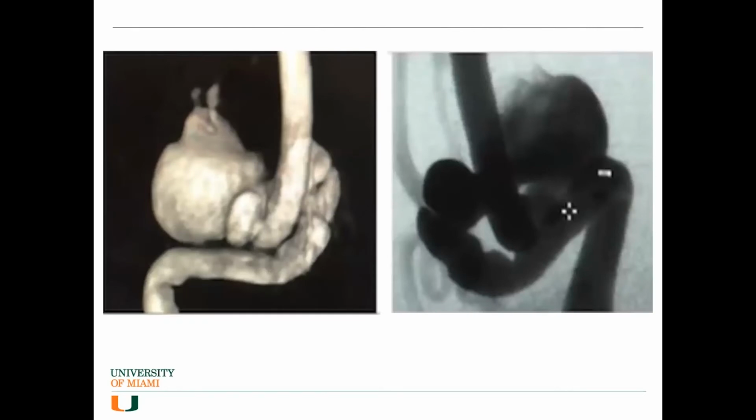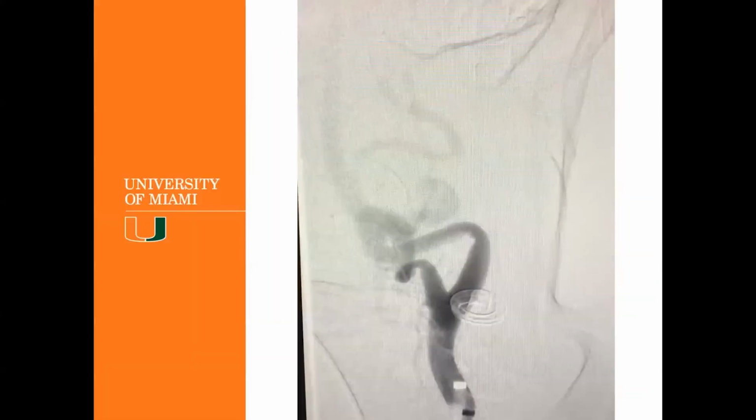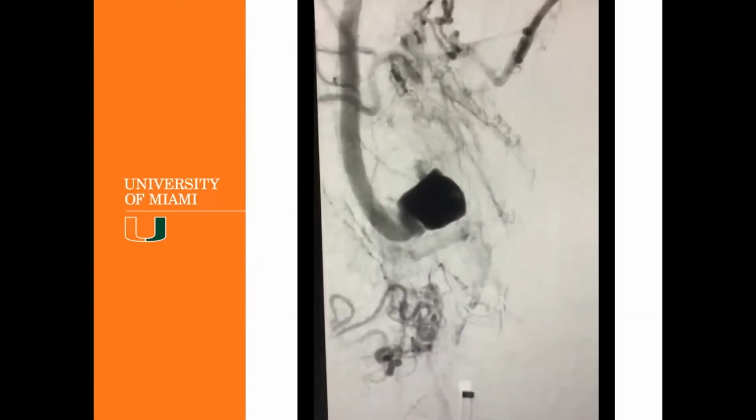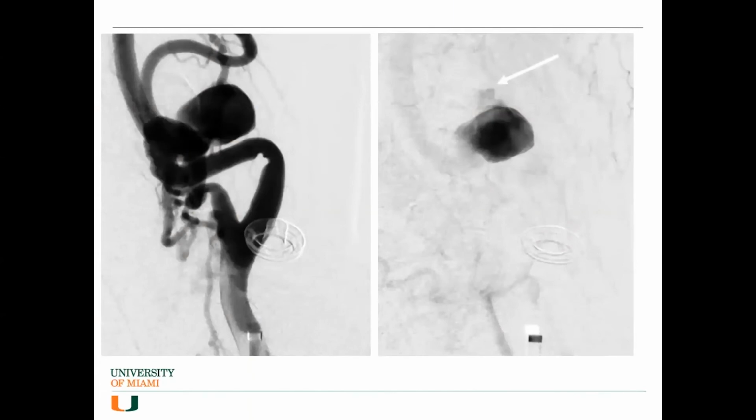Another reason that I was very unexcited to treat this. It's a little bit hard to even figure out what's aneurysm and what's vessel. This is what you can see here with the arrow in the delayed imaging. This aneurysm is actually much bigger on MRI than it is on angiogram. And something like the RAPID software can pick up these partially thrombosed aspects of the aneurysm and really show us these aneurysms are growing. This is the true lumen of the aneurysm. It's kind of confusing to understand even where the normal vessel is.